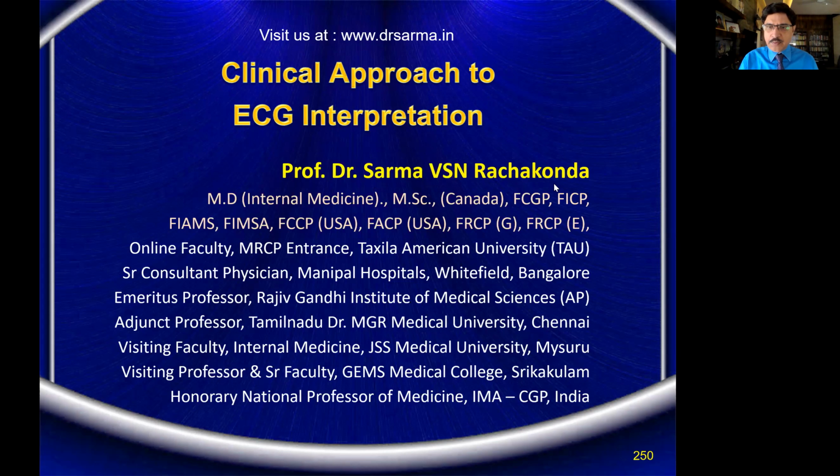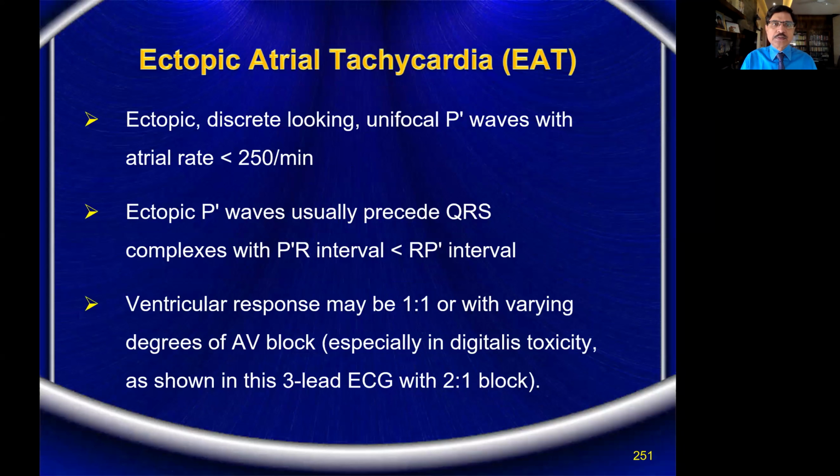also looked at the impulse propagation in case of premature atrial contractions. And then we have seen the 3 fates, fate A, B, and C. A is it will not get conducted because it does not cross the AV node and the bundles. And B is the one which crossed the AV node, but it could not cross the right bundle. So there will be a right bundle type of picture, that is RBB type of picture in the conducted beat. And C is, of course, it has cleared both AV node, LB, and RB.